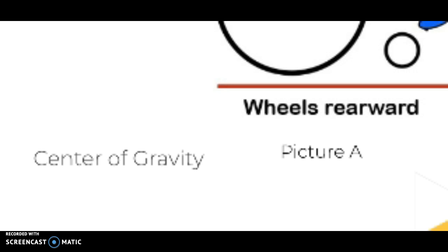If the center of mass is backwards and closer to the axis of the drive wheels, or even slightly behind, stability decreases and maneuverability increases. So understanding this relationship is important when setting up the wheelchair.